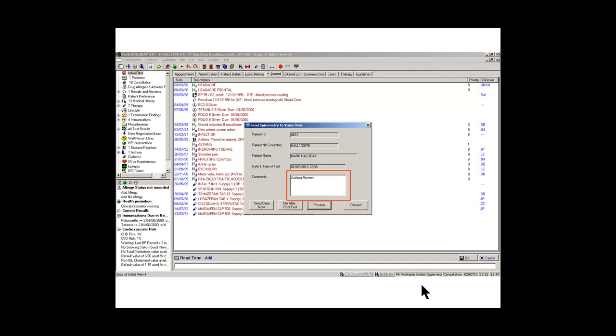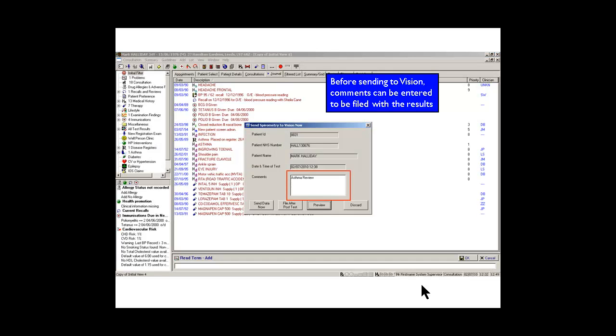At that point the window in front opens asking us whether we want to send the spirometry to Vision now. You can type in some comments.